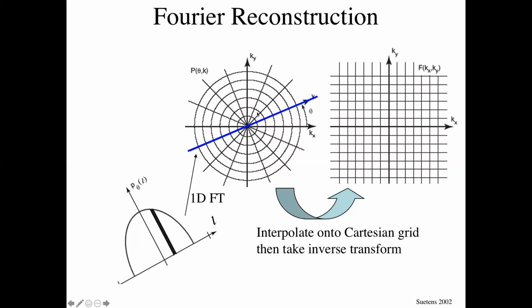Mathematically, you look at it and say, okay, I've got this radial sampling here, but oftentimes these points might not go through the middle. You have some very tiny errors in the Fourier data. And so when you do this interpolation under the assumption that your machine is giving you this, you get some artifacts in the pictures. So what is done instead is the back projection algorithm, but it's modified to correct for the fact that we have a lot of density of data in the middle.